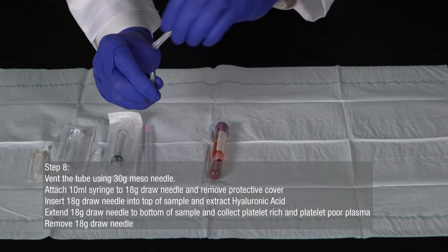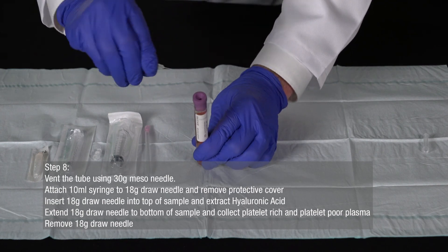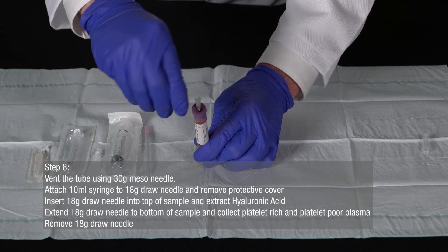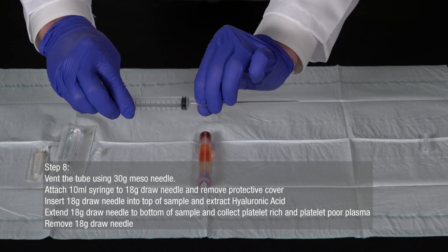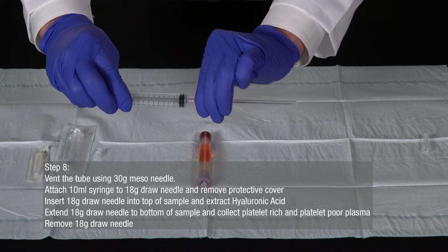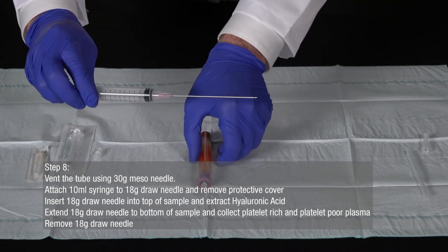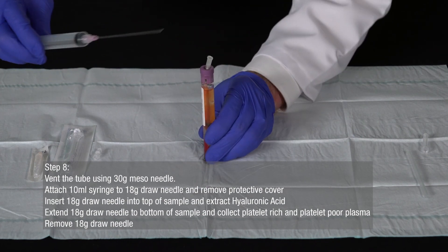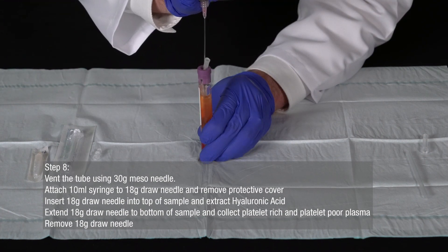To extract the hyaluronic acid platelet-rich plasma samples for use as facial filler, begin by venting the tube using the 30-gauge mesoneedle. Next, attach the 10-milliliter syringe to the 18-gauge draw needle and remove the protective cover. Hold your hyaluronic acid platelet-rich plasma sample tube upright and insert the 18-gauge draw needle into the top of the sample to extract the hyaluronic acid.